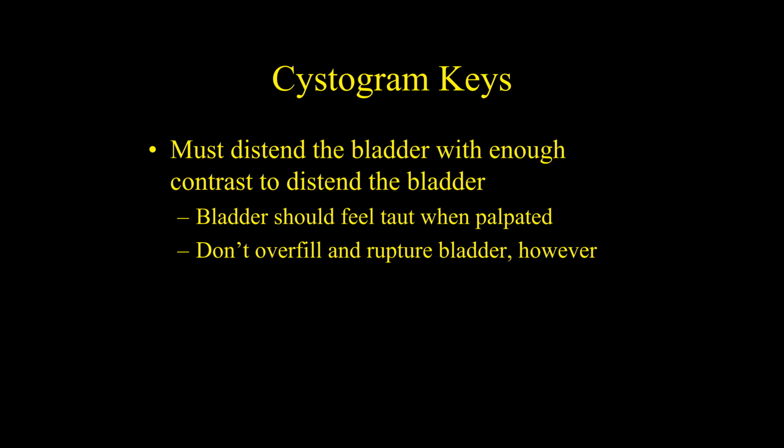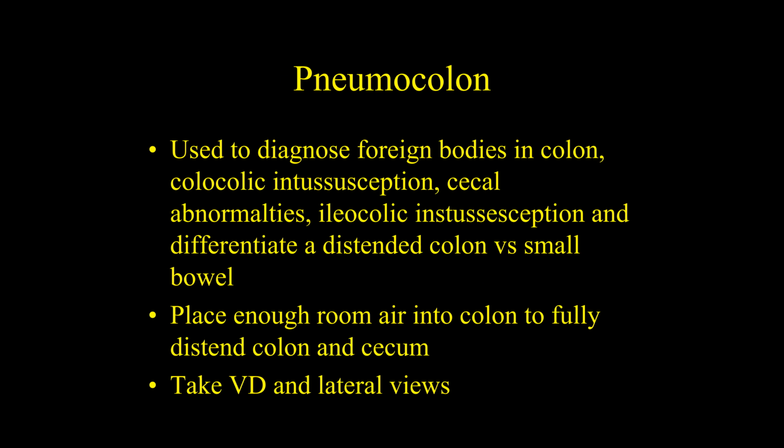Okay, you can't have a Labrador that could have a huge bladder and you inject 2 cc's of contrast material into the bladder. Doesn't make sense and it doesn't work. So you have to make sure and give enough contrast material to distend the bladder. Okay, the pneumocolon study, again, we talked about that.